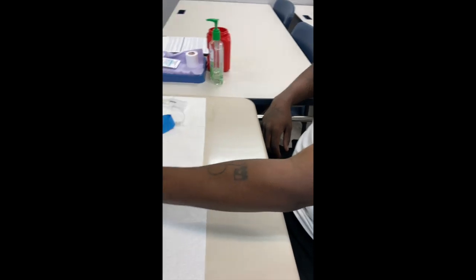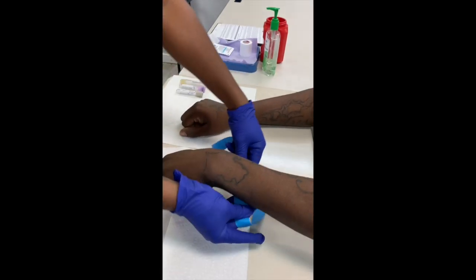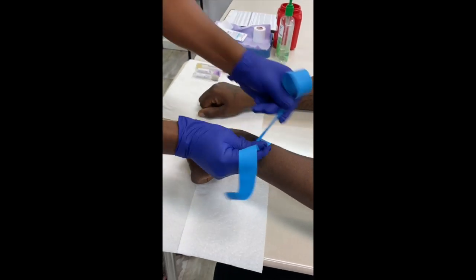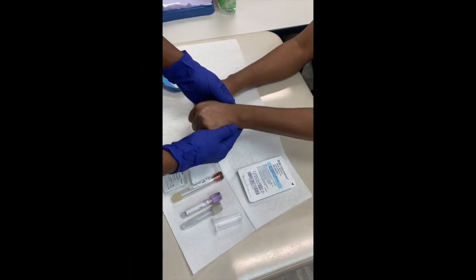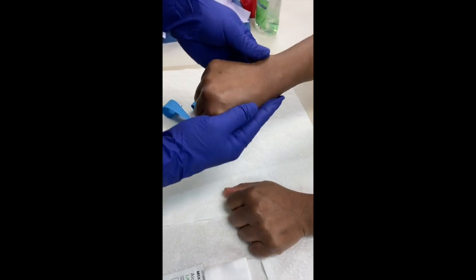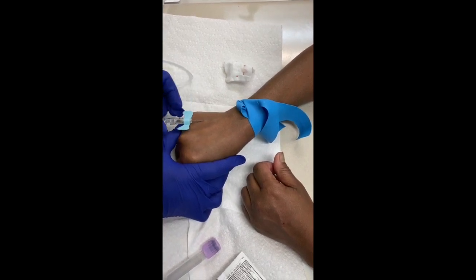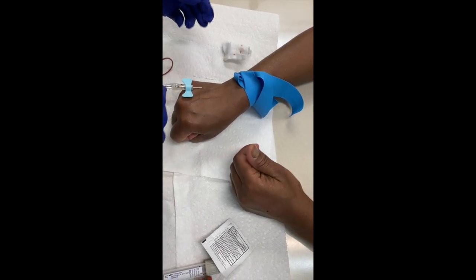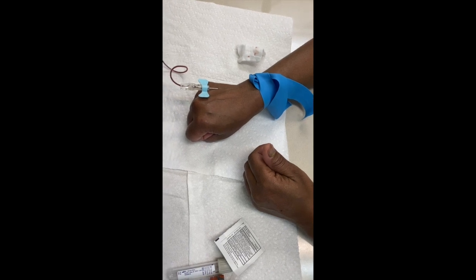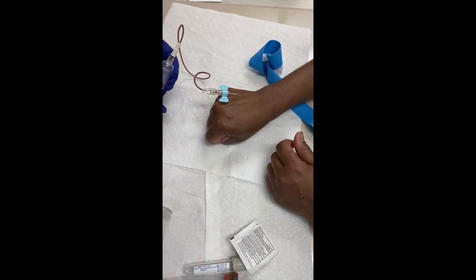Now we're going to apply the tourniquet and take a look at the arm. It looks like I need to go into the hand, so I'm going to look at both hands. Let's take a look at the hand veins, and let's check the other arm here. I see flash — and that's why you've got to get the right size butterfly for the right size of vein. We're not going to fill this one all the way up, so we're just going to take that out.